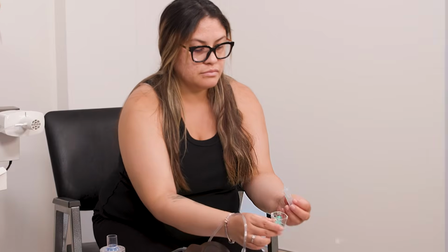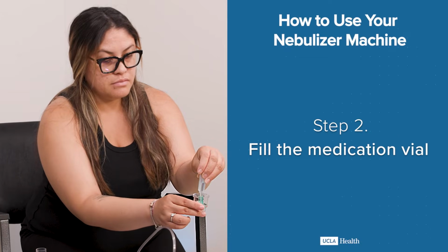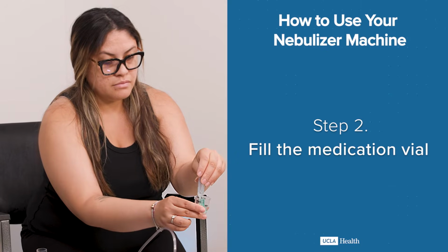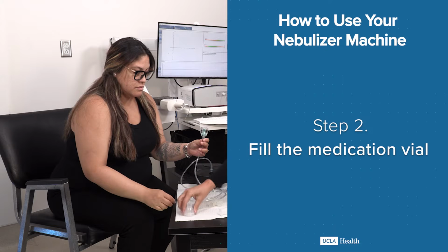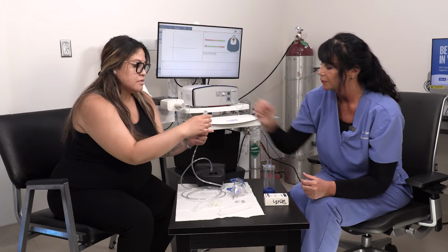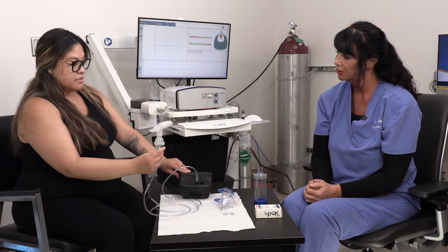Step 2. Fill the medication vial with the liquid that you have been prescribed. As the medication is turned from a liquid into a mist, you will then inhale the medication from the hosing and mouthpiece down into your lungs. Once you turn the nebulizer on, it will be ready for use.